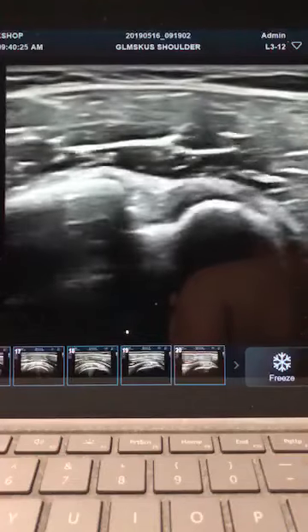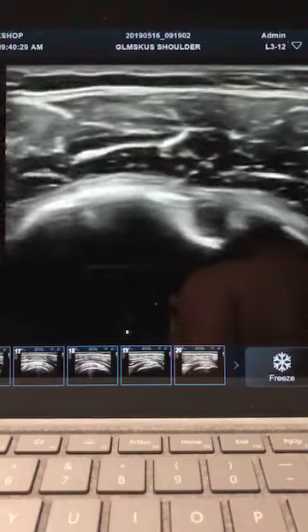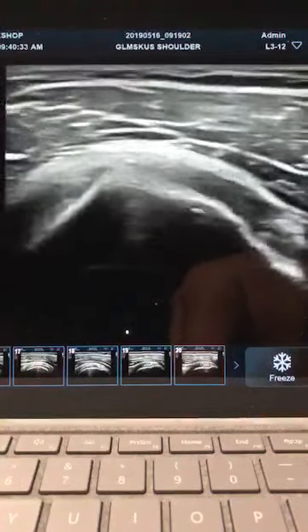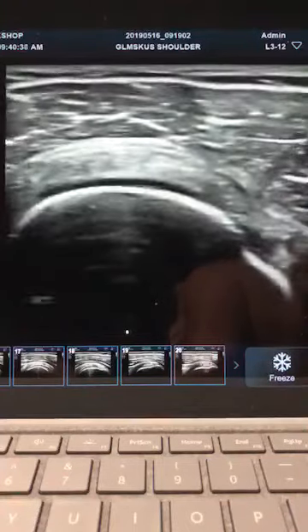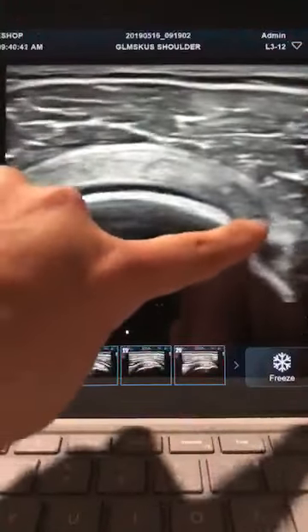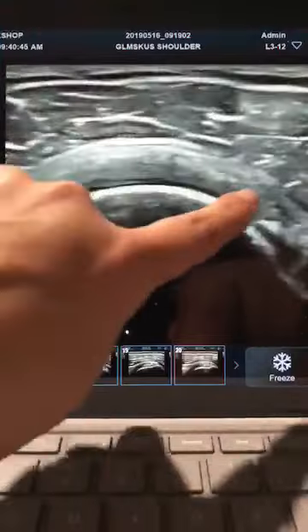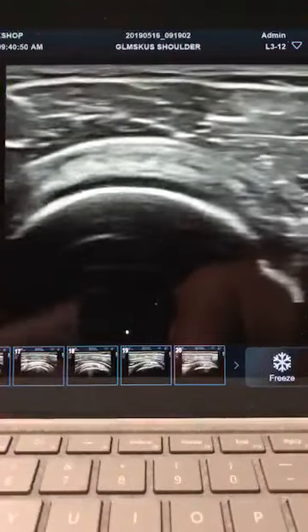I'd like to demonstrate how I evaluate the supraspinatus tendon. As I move the patient in the modified Crass position, hand on the hip, I'll scan superior along the humeral head at the level of the articular surface. As you can see here, we can identify that interval space as well, but we can also see the full width of the supraspinatus tendon, the anterior to posterior segment.